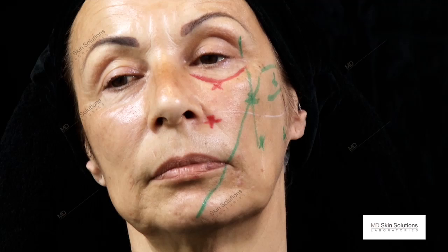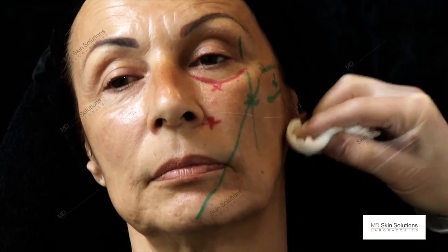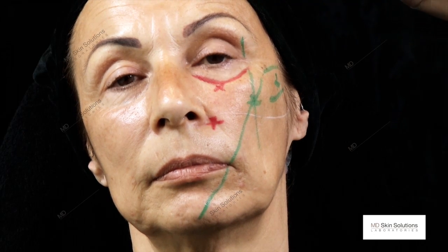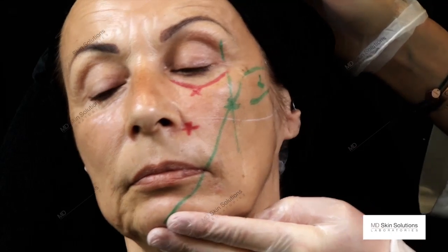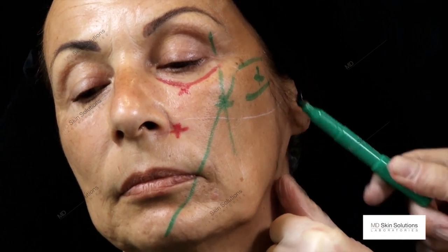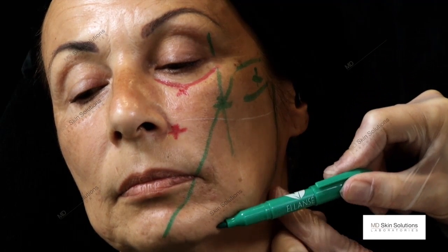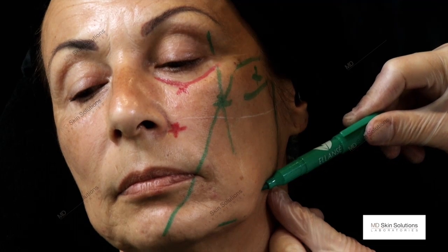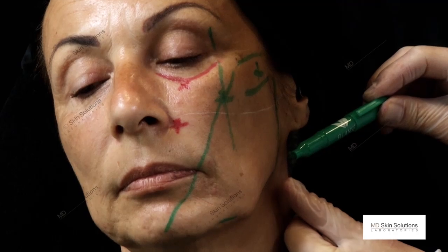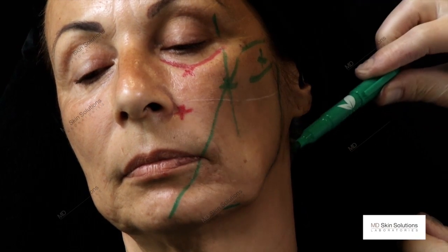In this case, I think we will not use these 2 points. For the strategy for the lower part of the cheek, the lines are the following. I look for the mandible angle, and I use the line running along the jawline, and we'll use this mandible entry point to redefine the jawline.